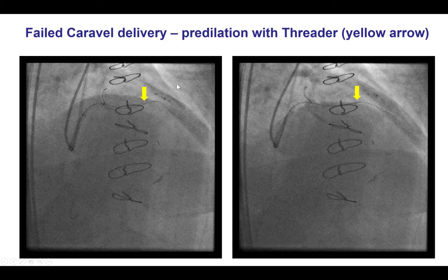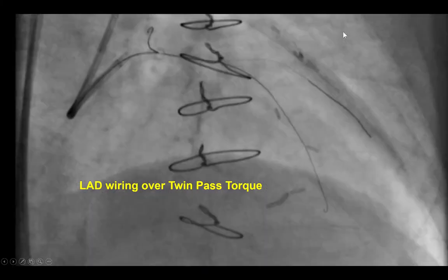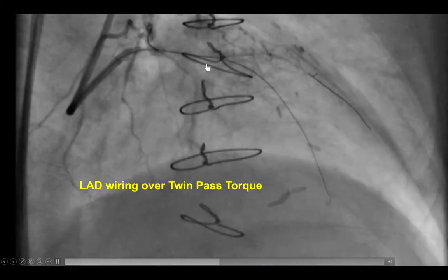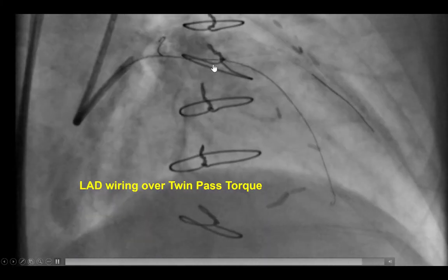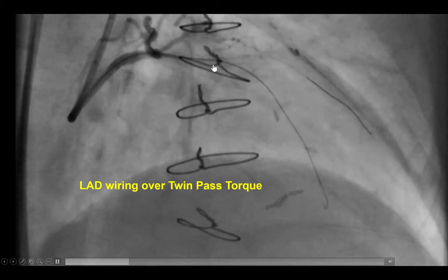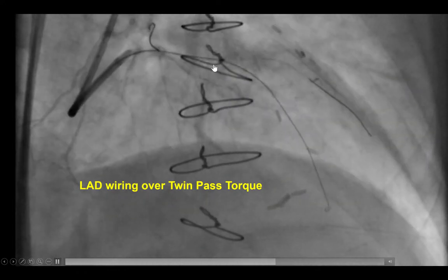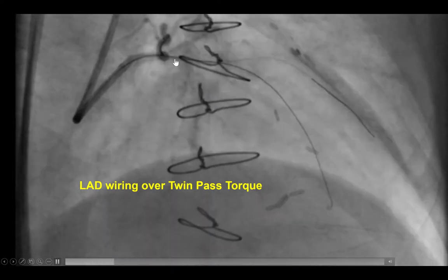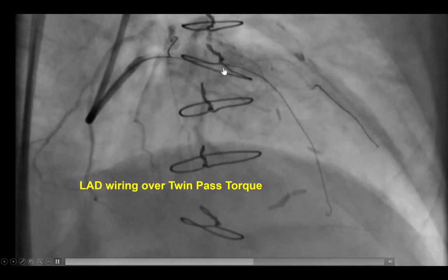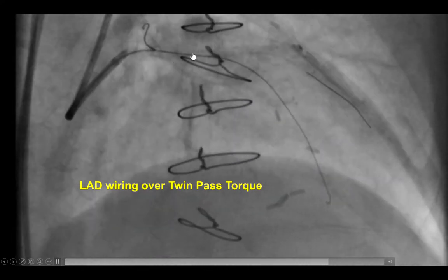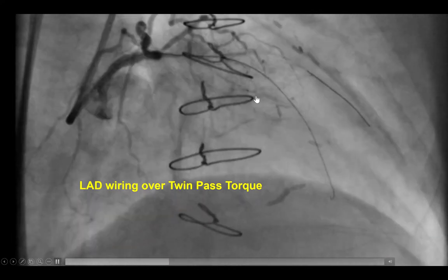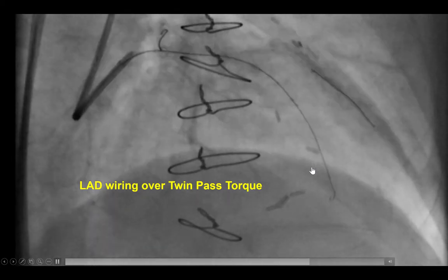In this particular case, we could not advance even the Caravel through the proximal cap, so it was removed and there was some predilatation done with a Threader balloon. After doing that, we were able to advance a Twin-Pass Torque, which is the only dual-lumen microcatheter available in the United States currently. Through the over-the-wire lumen of the Twin-Pass, we were able to advance a guide wire all the way into the distal LAD.